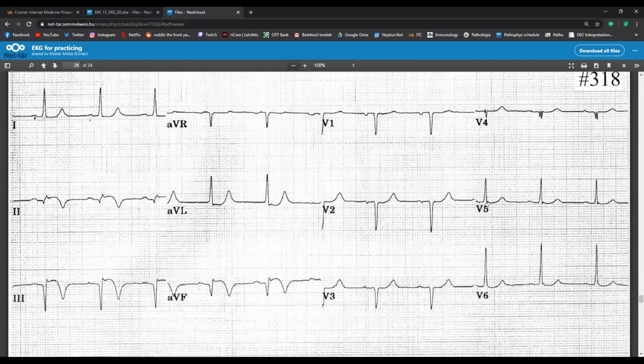Professor? Yes. I do have a question. What exactly is the distinction between old and current MIs? Okay. When we talk about MIs, acute usually means... I showed you last time, and I'm now doing the same again for you. Sharing this board. Especially I explained to you, I think, the posterior one.